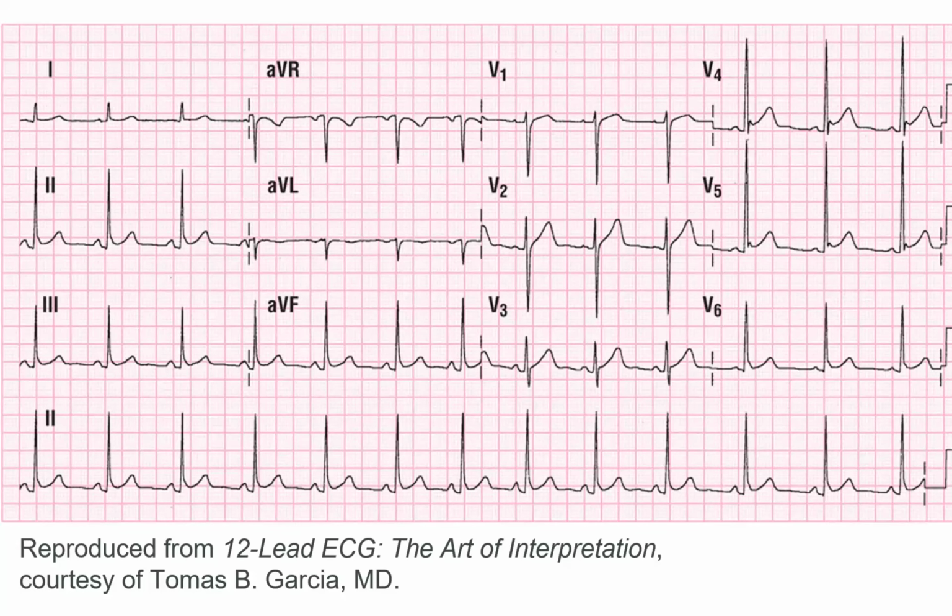Pretty neutral. Yeah, you might have a box, but you need 2 boxes, so it doesn't matter. V4? You definitely have a little bit there, right? Yeah, 2 boxes up there, but you don't have enough in V3. Do we agree? So does V4 matter? No. V5? Yep. Yeah, you got a box. Once again, a little bit of cupping. And then V6. Not enough in V6. Do we agree? Oh, well, maybe we don't.